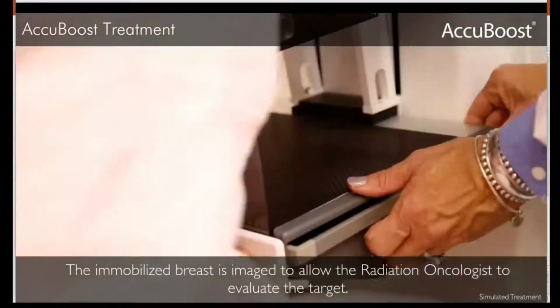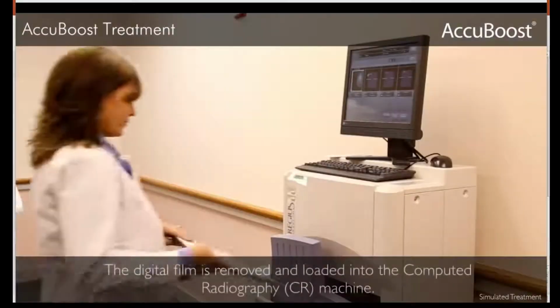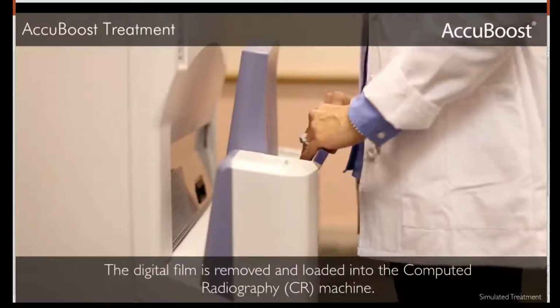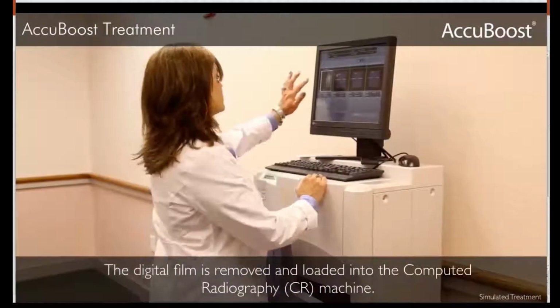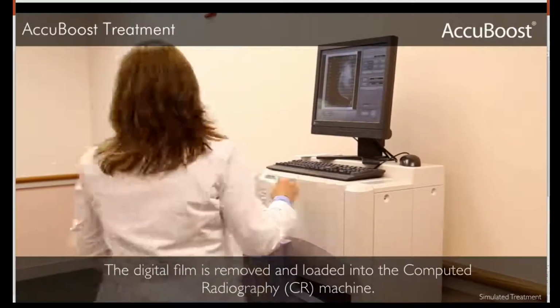Quick image is taken, and the digital radiograph is processed. And these images come up rather quickly.